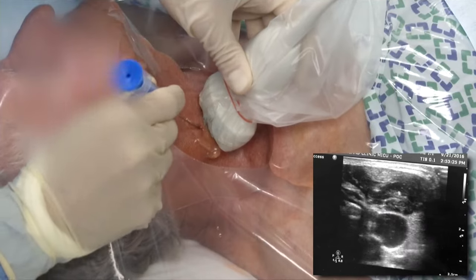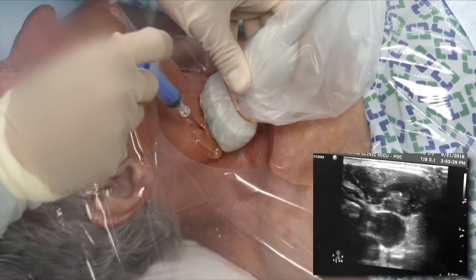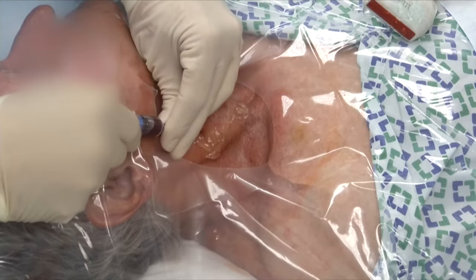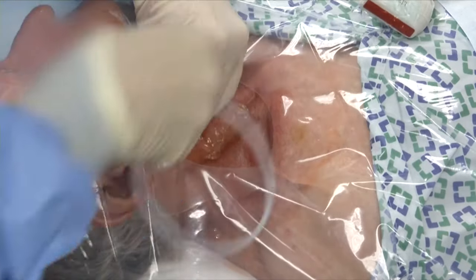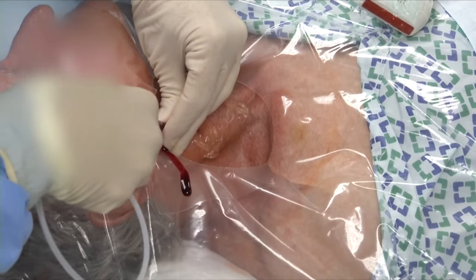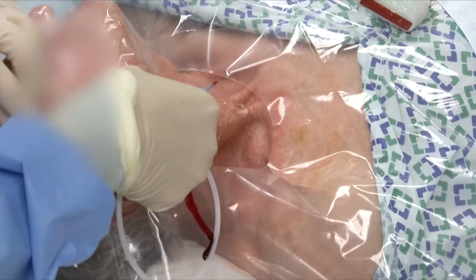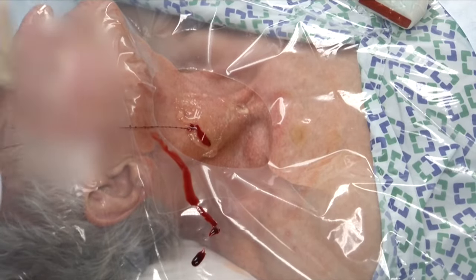Once the lidocaine injection is complete, the internal jugular vein is accessed under real-time ultrasound guidance using an 18-gauge needle. Once venous blood is obtained, the syringe is removed, leaving the needle in the vessel, and a spring wire is inserted through the needle into the internal jugular vein. The needle is then removed, leaving only the spring wire in place.